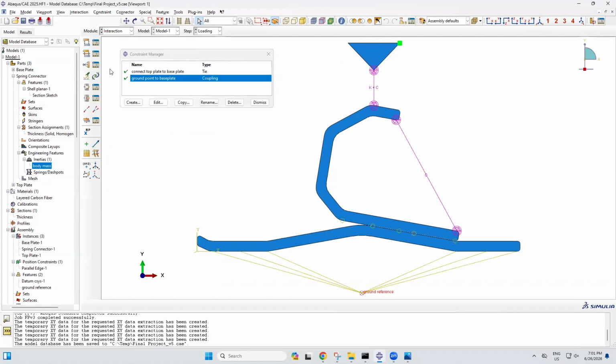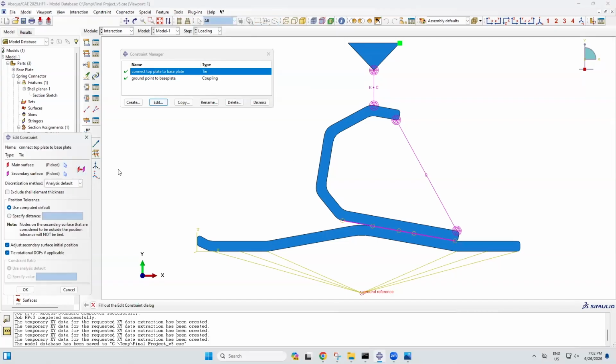Next is interaction. This is probably the busiest section for me in this model. Within the interaction, I created a tie and a coupling constraint, as well as 1 spring and 2 dampeners. The tie constraint connects the top plate to the base plate where they are tangent to each other. Here you can see I picked the bottom part of the top plate and I connected the top part of the base plate right here, this line, and this is to tie them together to prevent them moving apart and to replicate what would happen if they were bolted as in the regular or real life prosthetic.